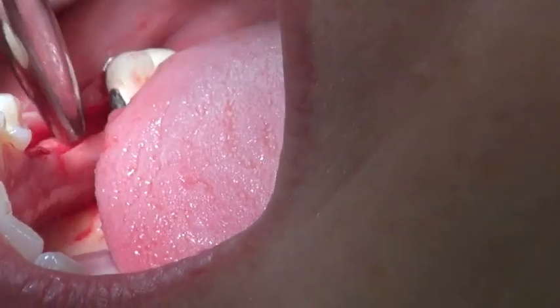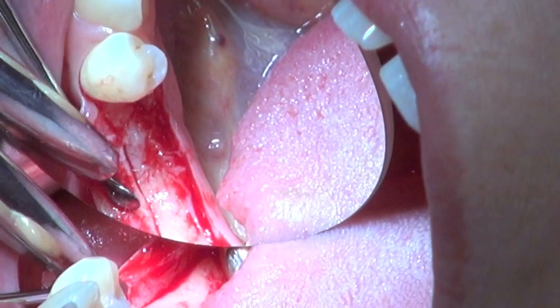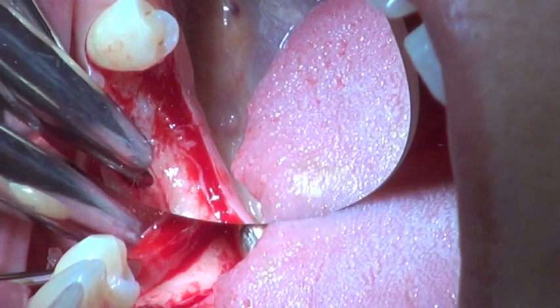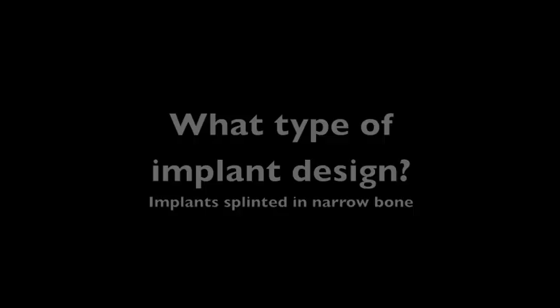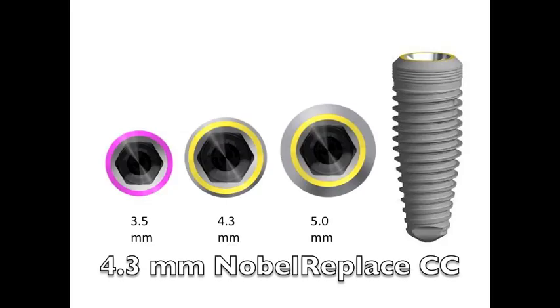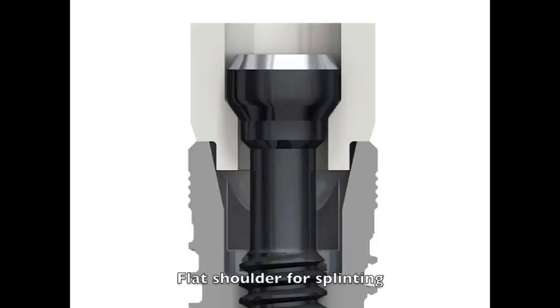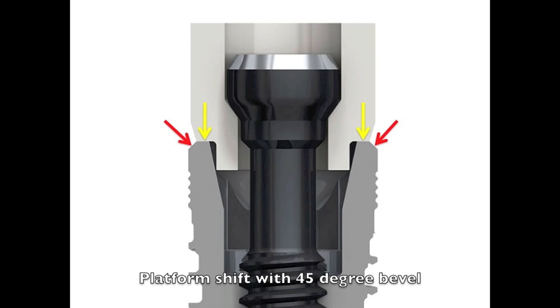We do a ridge flap and open it up for a look, and the bone has actually healed quite nicely in this case — a good start to a good case. Since I'm going to splint these implants together, I used the clinician software to pick an implant. I picked the Nobel Replace CC because of the uniform low pitch thread, which puts very little pressure on the ridge. I can also do a splinting job by having a flat platform on top of the implant, and with the 45 degree bevel I can still have a soft tissue seal around the top of the implant even while splinting.